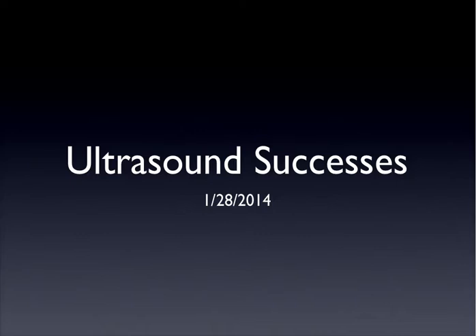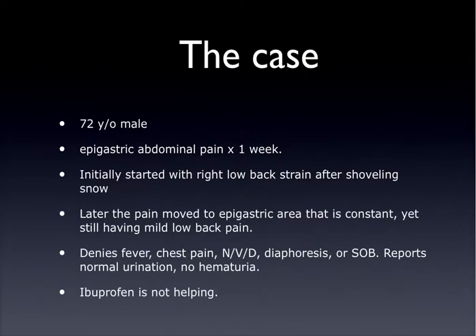The first case we have today was sent to us by Aaron Smith, one of our physician assistants. The case occurred literally 2 days after we did a course on ultrasound for the physician assistants, and from what she learned and remembered, she tried to apply it, and this was her case. She had a 72-year-old who came in with lower back pain and upper abdominal pain.